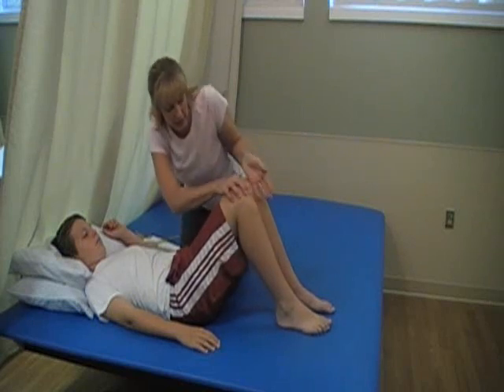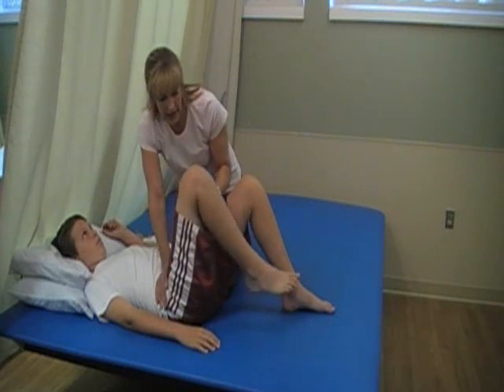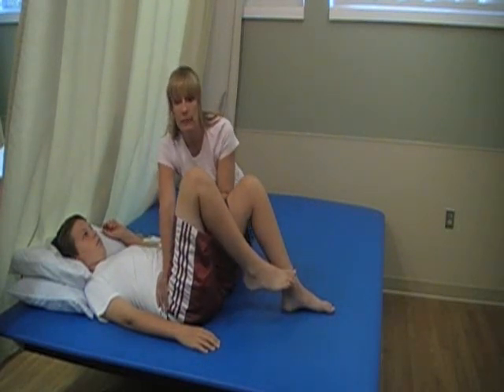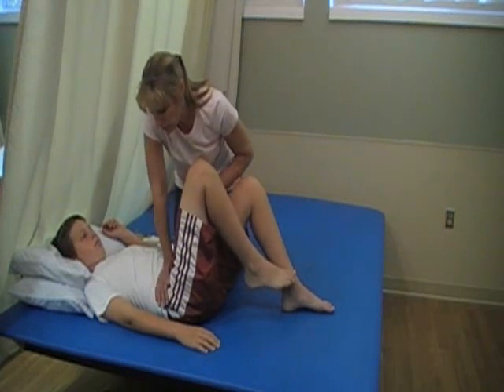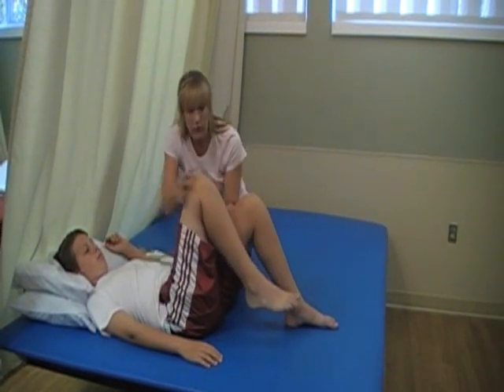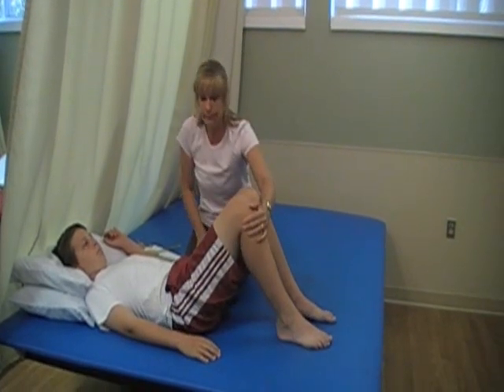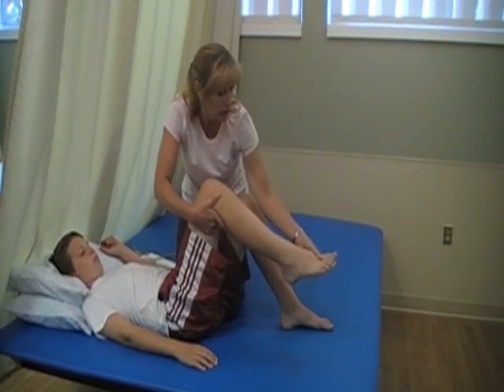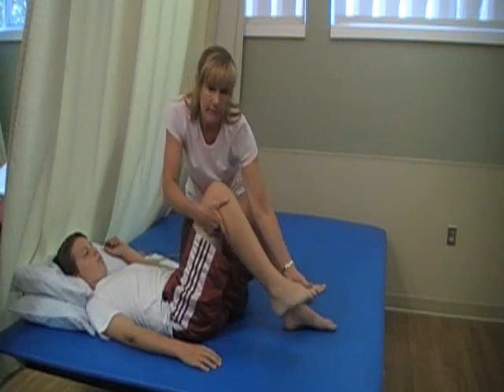So you want to look at flexion, abduction, adduction, and internal and external rotation of both of the hips. And you're going to note any restrictions. Remember that the end of range of motion is when the pelvis starts to move. So you want to note on your form any restrictions on either of the legs. The other thing you want to do in this position is make sure you look at the ankle. You want to look at plantar flexion, dorsiflexion, inversion, and eversion.